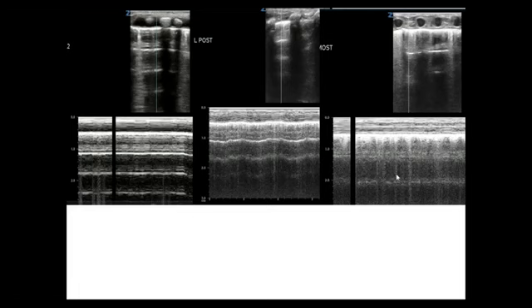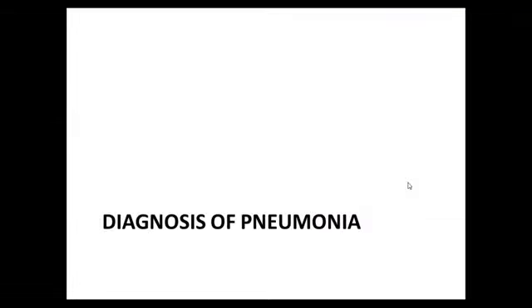So that's a lung after resolved pneumothorax post tapping of the chest by needle. Before, you have the barcode sign, just repetition of A lines, and there is no movement. And here you can see sky, sea, and shore or sand, the same as if you are at the beach.